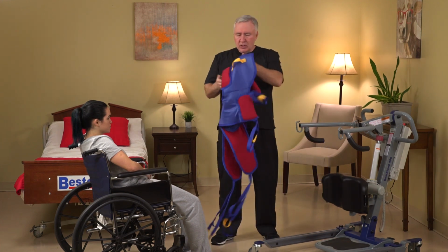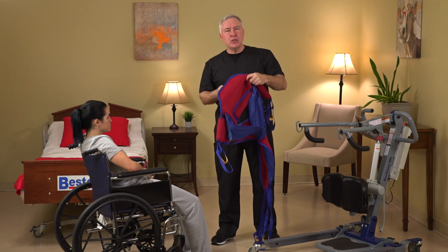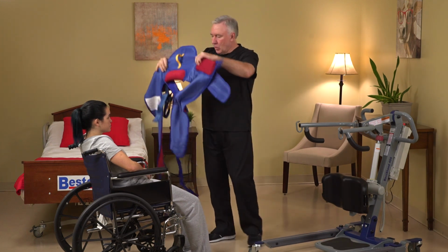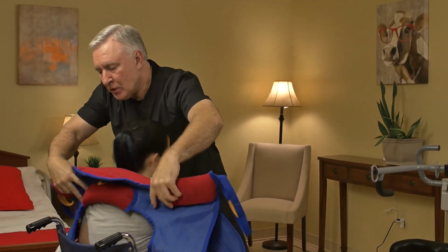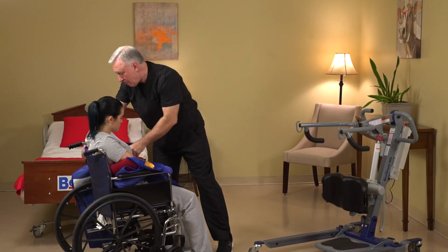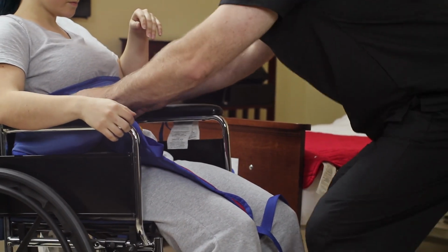So you can see the Sani sling is shaped like a U. It's shaped this way so I can tuck it around my patient while they're in the wheelchair without the need to move the patient. So what I do is I simply hold the sling in this fashion, tuck it behind the patient's back into about the same position that the sit-stand sling is in. I've got a little support belt that I can bring around the patient's waist that has Velcro to help secure it in place.